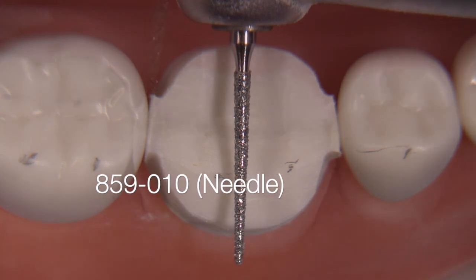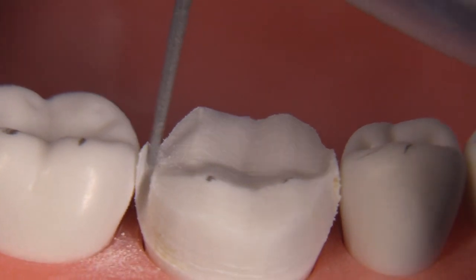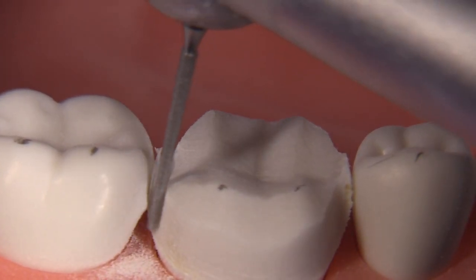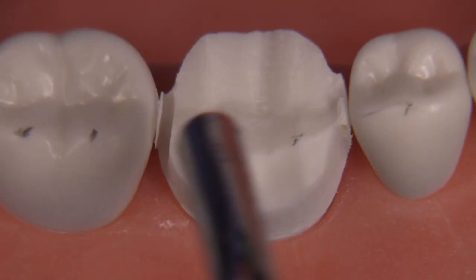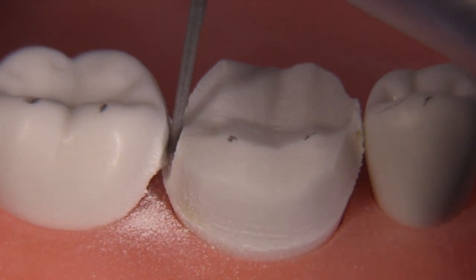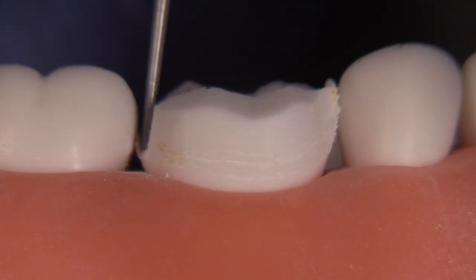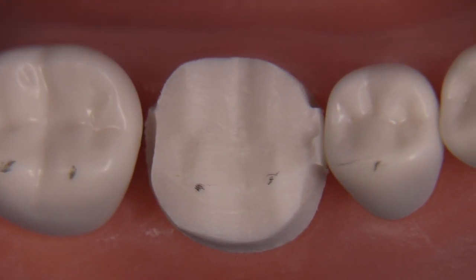For interproximal clearance I like to use a needle-shaped burr — this is an 859010, very skinny. You could also use an 850012; some people even use a 169L. There are really three keys when trying to break interproximal contact: don't go too deep axially, don't over-taper, and don't hit the adjacent tooth. It's tough to do the first two, but we can definitely protect the adjacent tooth by leaving a little sliver. Remember, during this interproximal clearance step we are not interested in developing a perfect finish line — we're just interested in clearing the tooth from between the teeth.